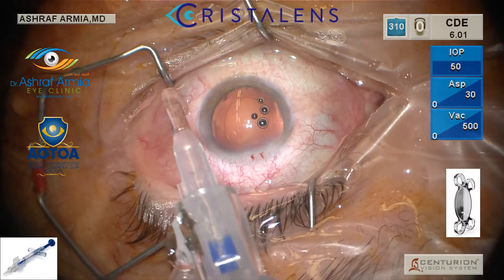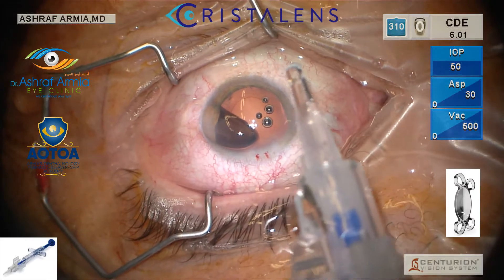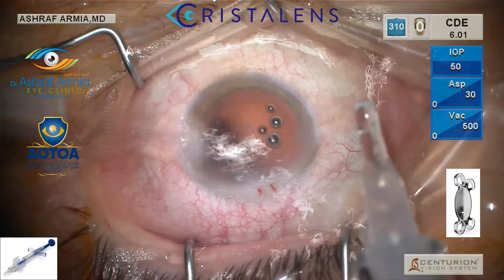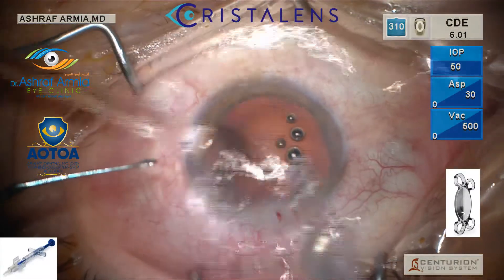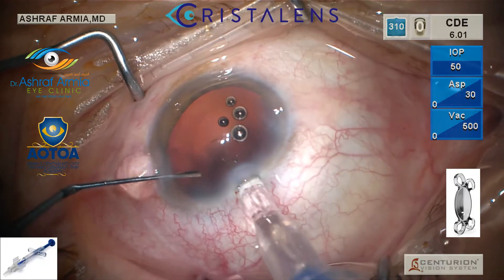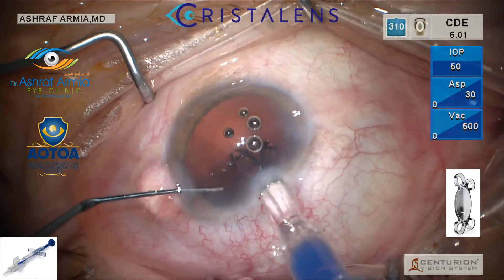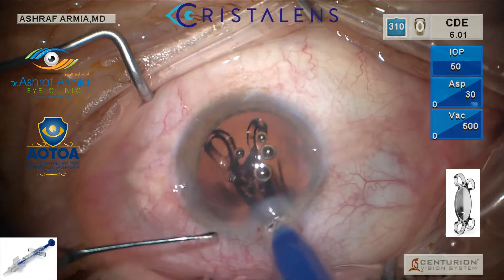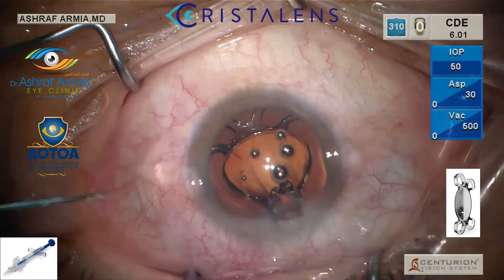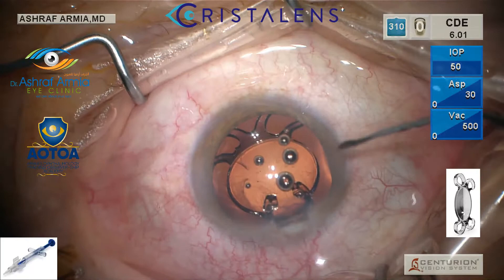This is the second click. During the injection, hold the eye with the second instrument. You are going to see how it's smoothly injected and unfolded. Once injected in the eye, it's very smoothly and rapidly unfolding from the cartridge.